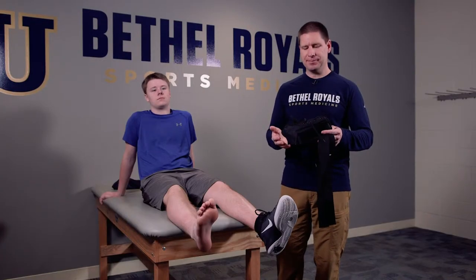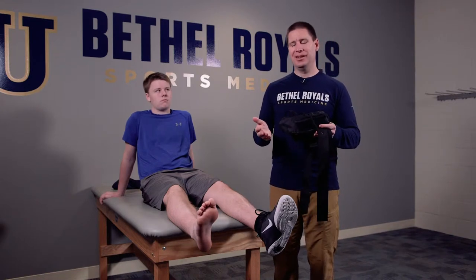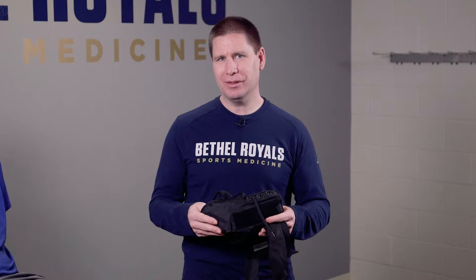Today we're going to be demonstrating fitting for an ankle brace. There are all kinds of ankle braces that you can use — they range in cost, size, color, and style. You can really pick any particular one that you want.